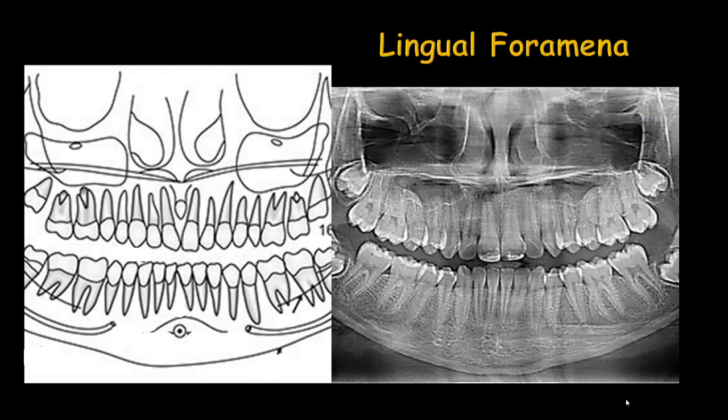The lingual foramen is beneath the central incisors in the mandible. It can sometimes be seen in the panoramic radiograph, but because of superimposition of the ghost image of the cervical vertebra in this area, it is sometimes not very well detected. If you see a round radiolucency in that area beneath the central incisors, you can identify it as the normal anatomical landmark for the lingual foramen.